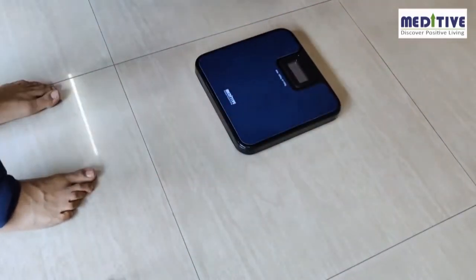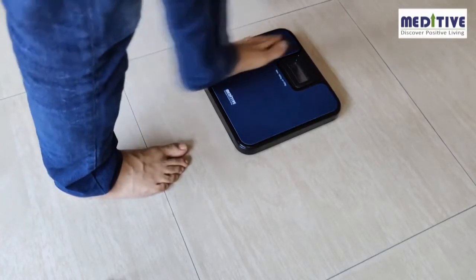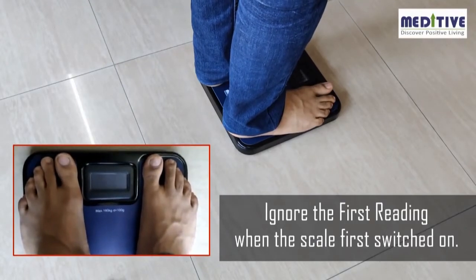Now keep the scale on a hard, even surface. Do not keep the scale on carpet or any other soft or uneven surface.